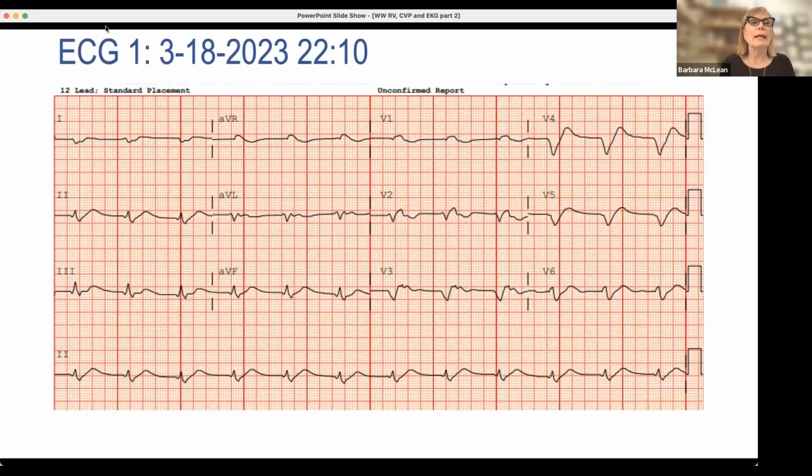Okay, here's her next EKG. Okay, now it's not noisy, so that's great. Doesn't really appear much better than the first one, right? It's not much later. It's a much better EKG. But if I look at this, I can't make a case that the patient has P wave to QRS. I feel like this is idioventricular, which means that her ventricular impulses are what are promoting cardiac electrical depolarization, cardiac contraction.